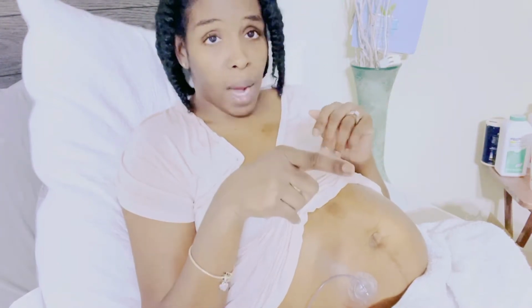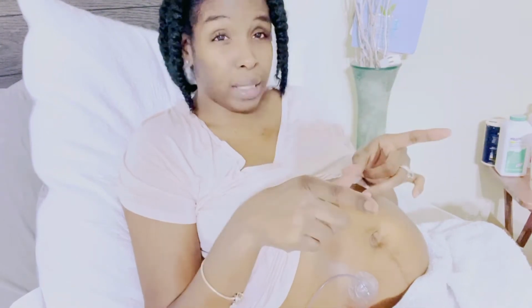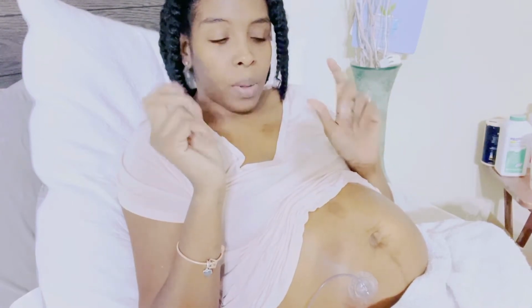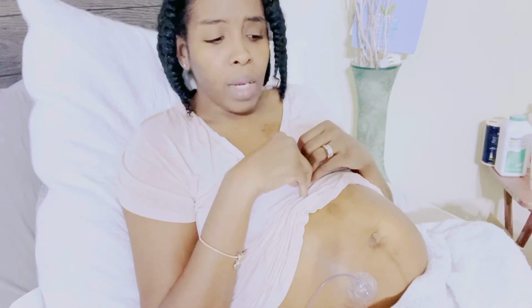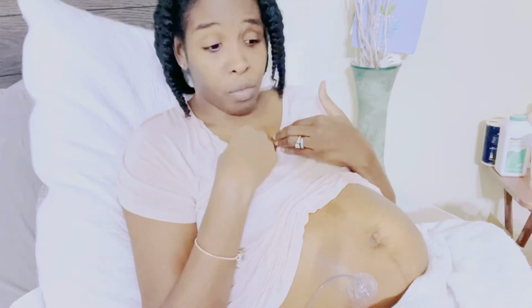I do have a biohazard needle stick container that I bought from Walgreens for, I think, $11.99. I put my needles in there. I don't get a new one from insurance or anything, I have to pay for it myself. So I only put my needles in there.